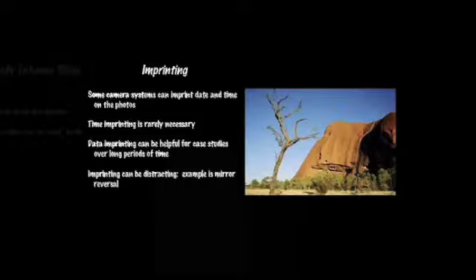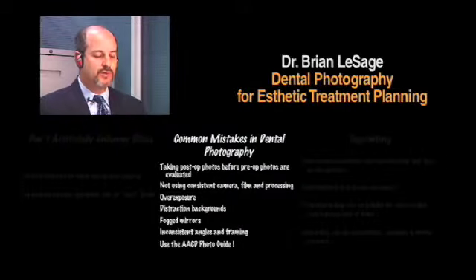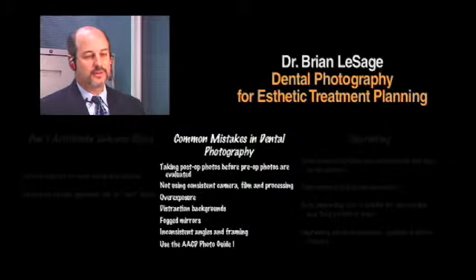It had the date right on the slide, and you didn't have to remember how old they were, and the audience didn't just have to trust you, which I know our audiences trust us as public speakers, but I just like to have the dates there. I think it's a little cleaner. And be careful. Obviously you want to take the pre-ops before the post-ops. Don't forget those pre-ops. Using consistent film or processing, that's really a key if you're still in the film world.